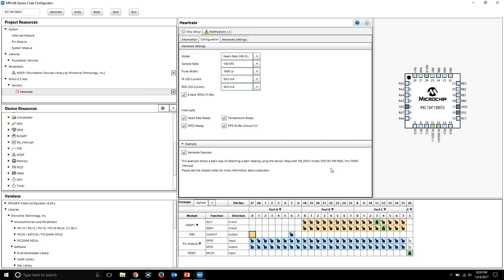And there's one more thing. It also says you have to set up a 1 millisecond timer 0 interrupt. So what we have to do is add a timer and set up that interrupt. This is for the timing purposes to send the data. So is that for the Xpress evaluation board? That's correct. So I have to go back and add that to my project, and it's very simple, guys. You can see how I can just go and add the timer. Show us how simple. Yeah.